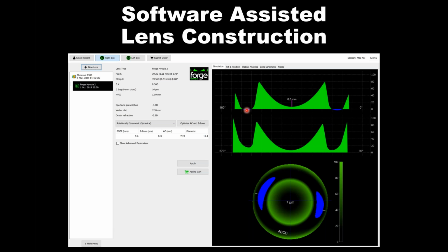So to get your bearing, the corneal surface is right along the bottom of the x-axis. So that's your corneal tissue. Then where you see the blue, that's where the lens is in touch with the epithelium. And then of course, we're looking at the tear layer profile, or what you might call the tear layer thickness. Lens close to the corneal apex with that deep reservoir of fluid to create our ortho-K effect, the hydraulic force that gives us the central corneal flattening and the paracentral steepening. Then, of course, we need the alignment with the peripheral cornea to stabilize the contact lens.